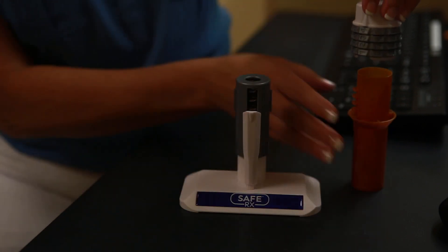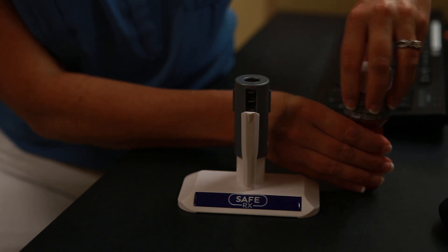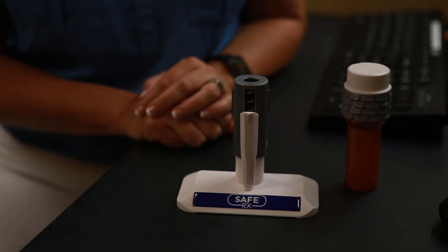And once you've set that, you stick it right here on the bottle, twist, and you're all done. That's as simple as that is.